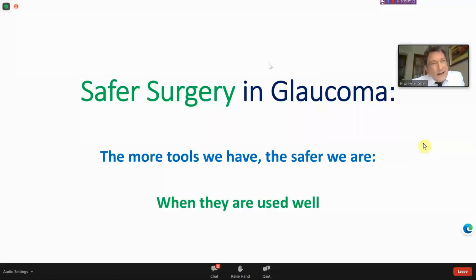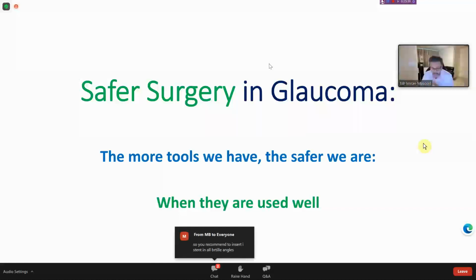I would say in a very small number of cases, I have seen a little bit more inflammation than you'd want post-phaco. And I sometimes wonder, Imran, whether some of those SLTs were done by junior surgeons that perhaps SLT'd the ciliary body a little bit too much, or the iris root. But certainly in my own experience, I haven't found that SLT prejudices the outcome of iStent technology. Have you? No, I agree with you.